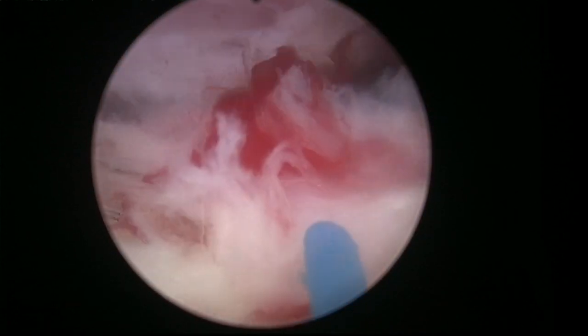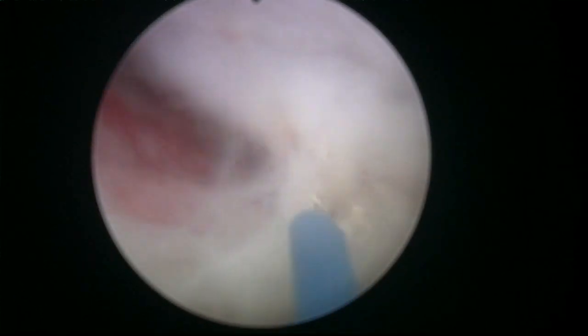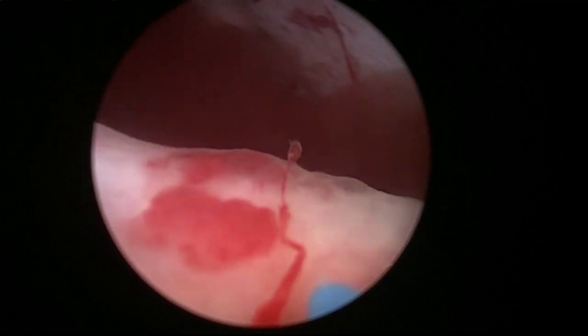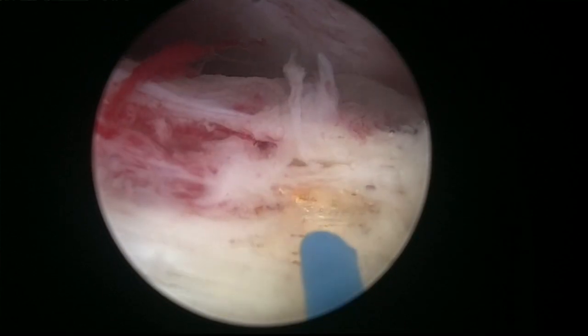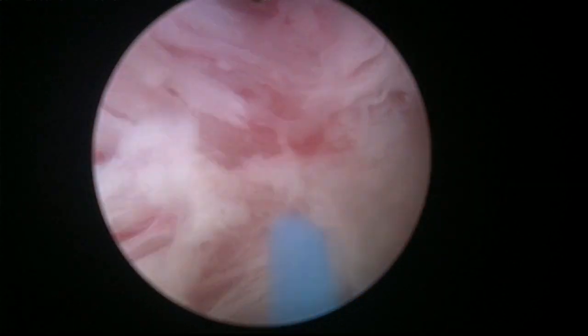One of the things that is not so nice about the holmium is its explosive nature. When you get to the mucosa, sometimes it generates a little bit of bleeding. So these mucosal vessels tend to bleed a little bit. That's the UO again. It's safe but close as well. So you have to insist a little bit to do hemostasis. But we finished.